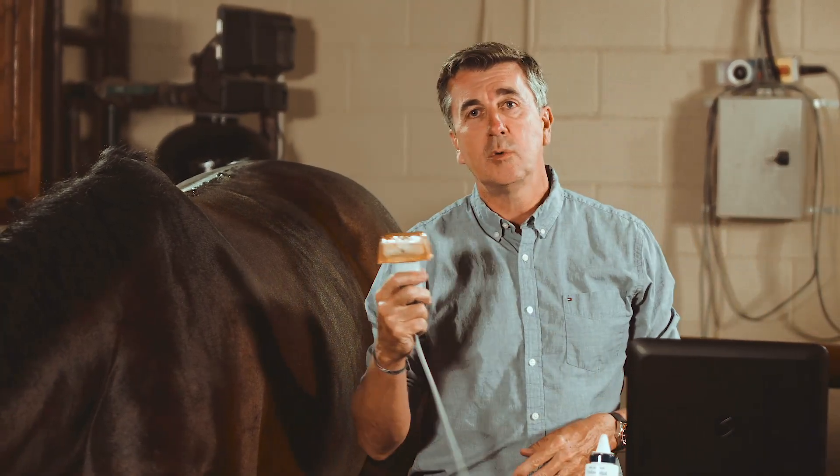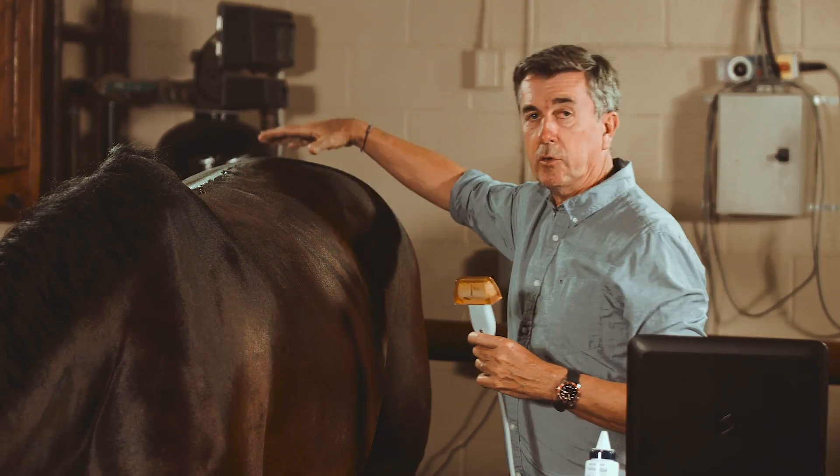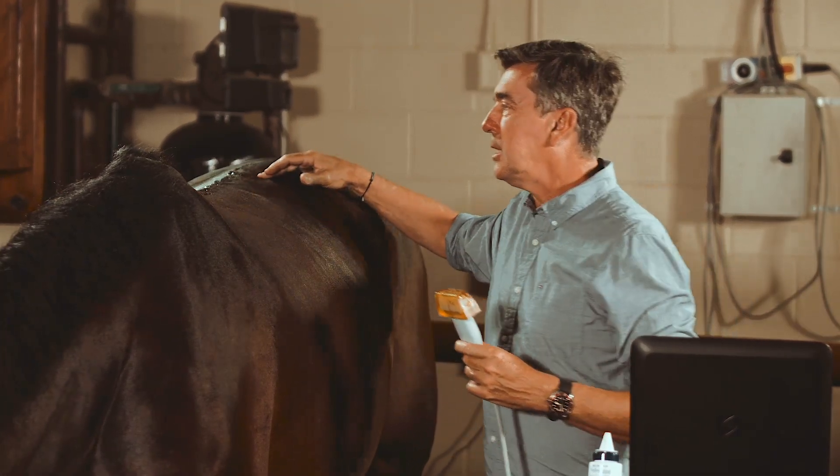Today we are going to evaluate the back of the horse with ultrasound examination. I take this opportunity to acknowledge my mentor and professor Jean-Marie Denois, who taught me all these techniques.